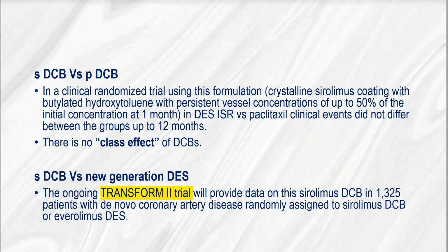In a recent clinical randomized trial comparing sirolimus with paclitaxel, there is no difference after 12 months. There is no class effect of drug-coated balloon. And there is the ongoing TRANSFORM II trial comparing sirolimus drug-coated balloon versus new generation drug-eluting stents.